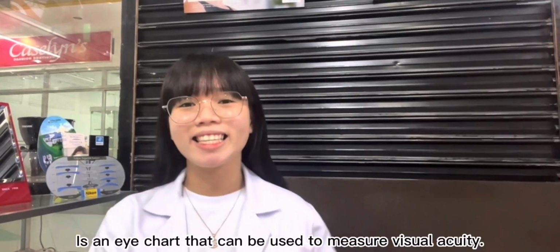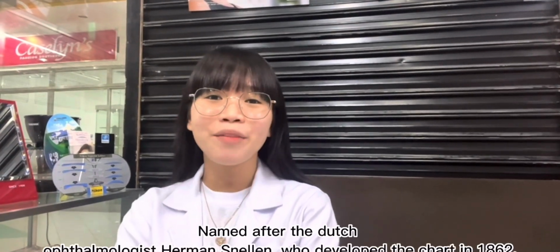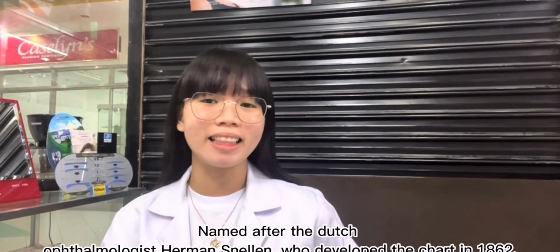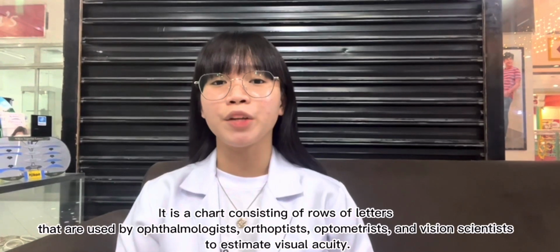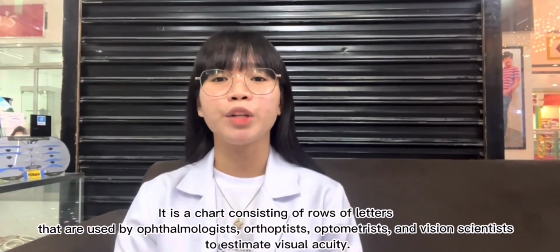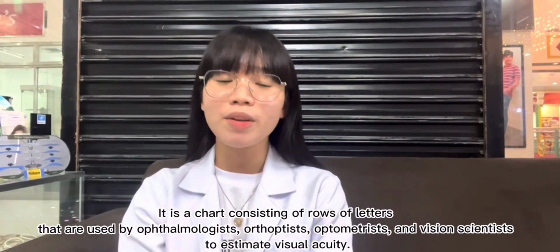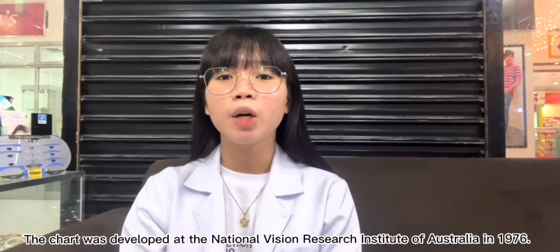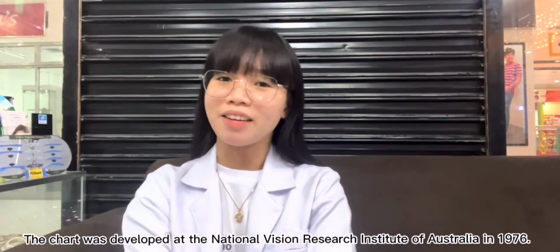Snellen chart is an eye chart that can be used to measure visual acuity, named after the Dutch ophthalmologist Herman Snellen, who developed the chart in 1862. Logmar chart or logarithm of the minimum angle of resolution chart. It is a chart consisting of rows of letters that are used by ophthalmologists, orthoptists, optometrists, and vision scientists to estimate visual acuity. The chart was developed at the National Vision Research Institute of Australia in 1976.